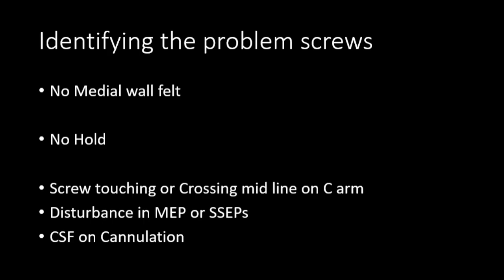So if there is CSF coming out after cannulation, that's also a bad sign. Also, if you have neuromonitoring, any disturbance in MEP or SSEP, you can identify the problem pedicle screws with that.